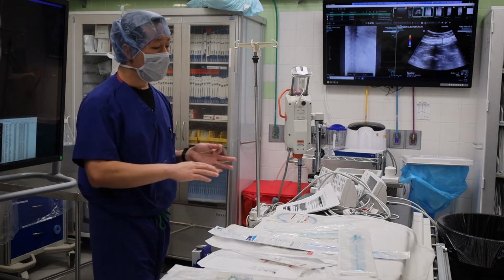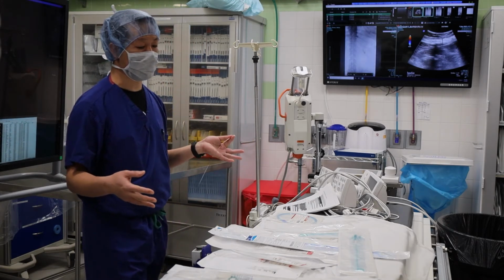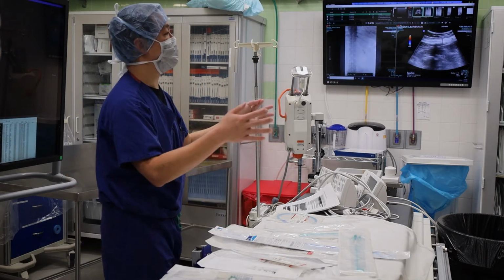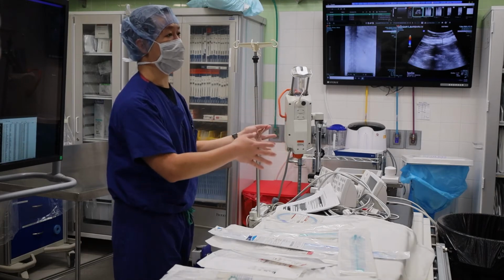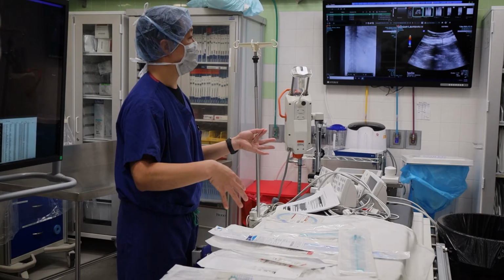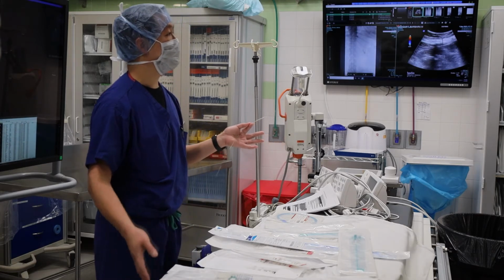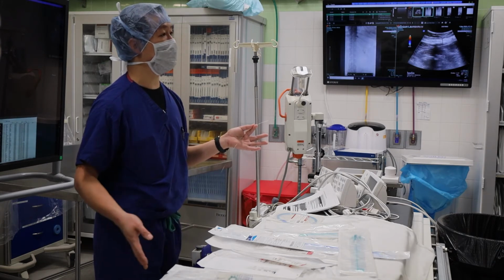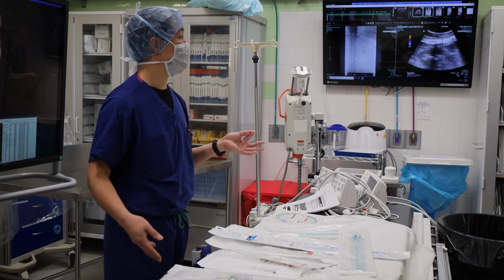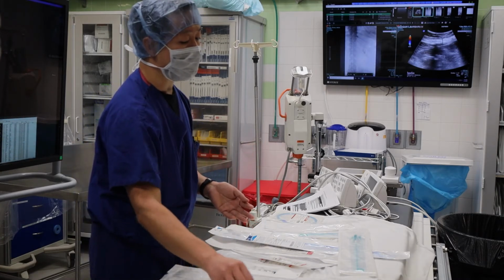So, because I don't think Dr. Shi talked about this on the last topic for lines and central venous devices, but the choice of wires in IR do not overlap with the choice of wires in cardiology or vascular surgery. The wires are all designed for a specific part of the body. And so some of the wires that are used, say for tibial drilling, or other things like recan wires, we do not use in IR unless we're down in the leg. Okay. And so those are some of the 0.018 wires we might use.